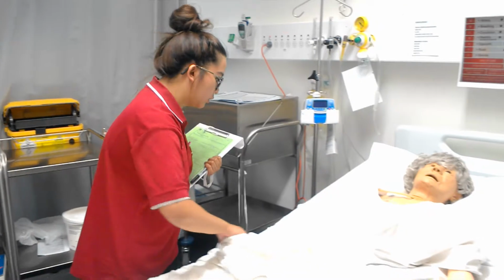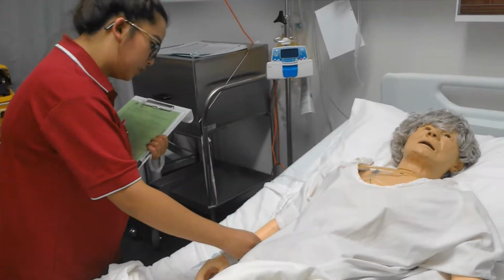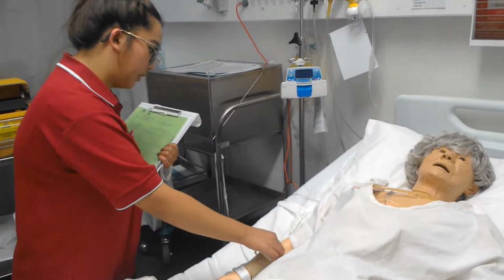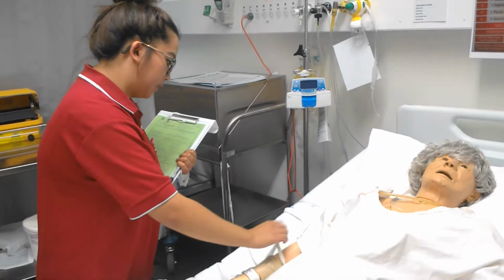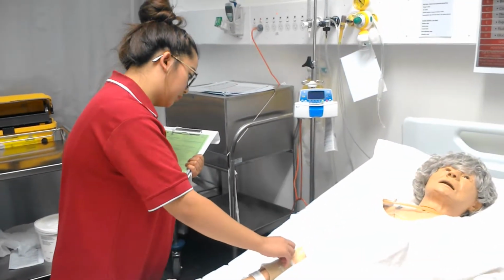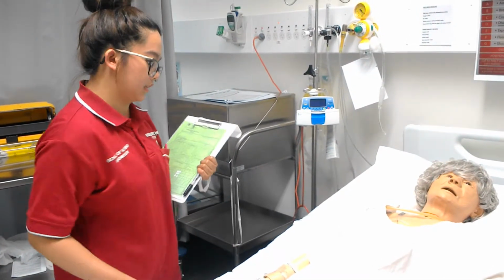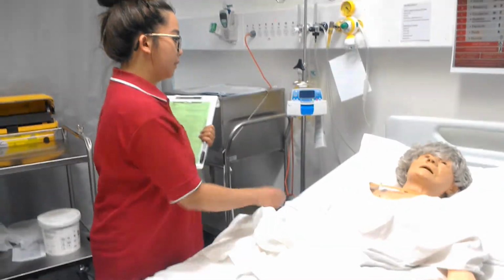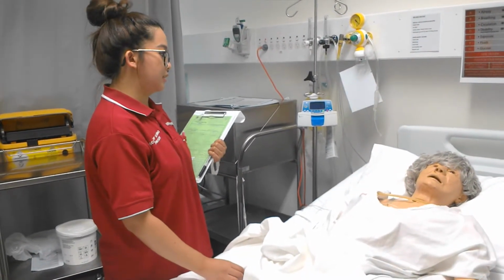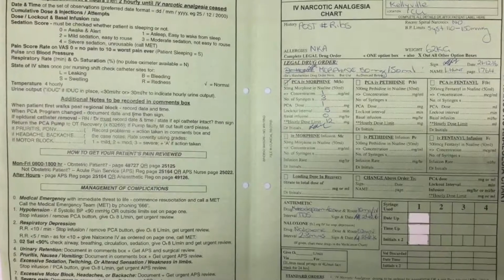Also, I'll just double check your cannula site to make sure it's okay for me to process that medication. So is there any pain when I press here? No. Okay, so I know that the cannula site was put in less than 72 hours ago, so it's okay for me to also administer medication there. There's no signs of inflammation or redness. Okay, so I'll leave you with the buzzer for the meantime. So if you do have any questions or if you do need assistance, you have a buzzer to press. So I'll come back and just gather the equipment.